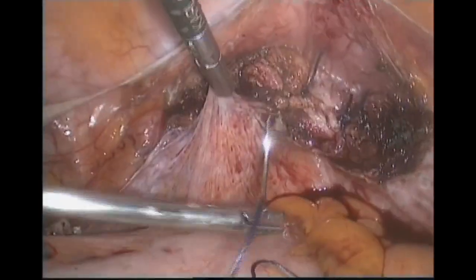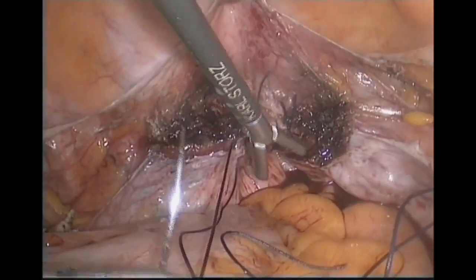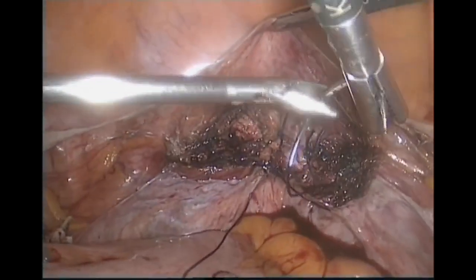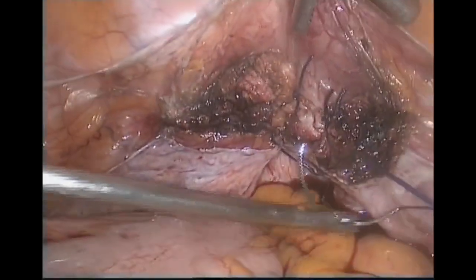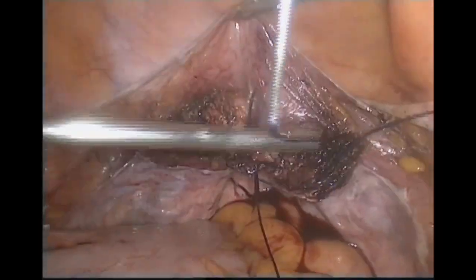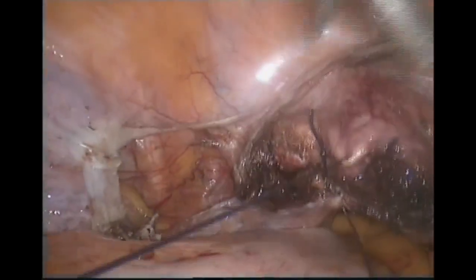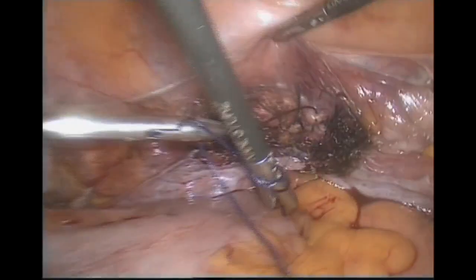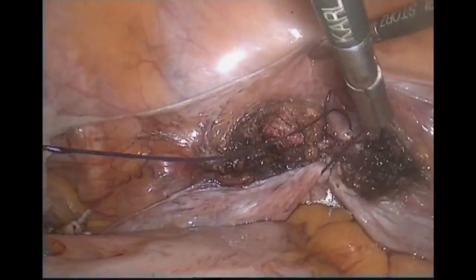Please take the fimbria and the tube completely to avoid any cancer later on. Drop the pressure to check the hemostasis. So four rules, Hamamsy's rules: identify the ureter before dividing any lateral pedicle, IP ligament, and uterine artery. Hug the ovary, hug the uterus. The colpotomy cup is your ureteric protector. Seal the uterine artery medial to the rim. Take the whole tube, including the fimbria, in the salpingectomy. Drop off the pressure to check the hemostasis.